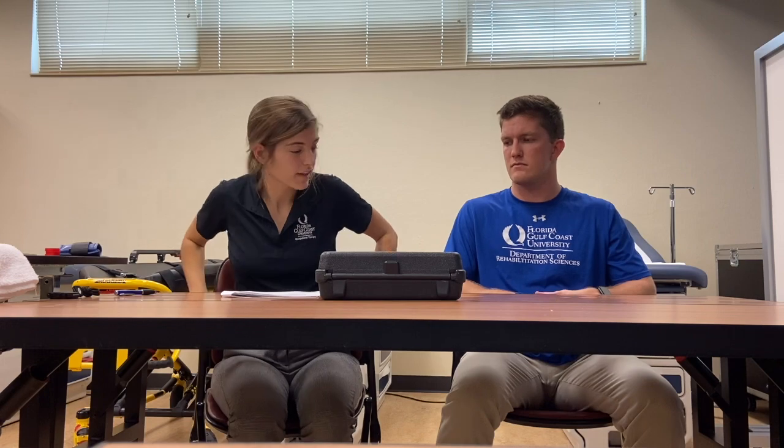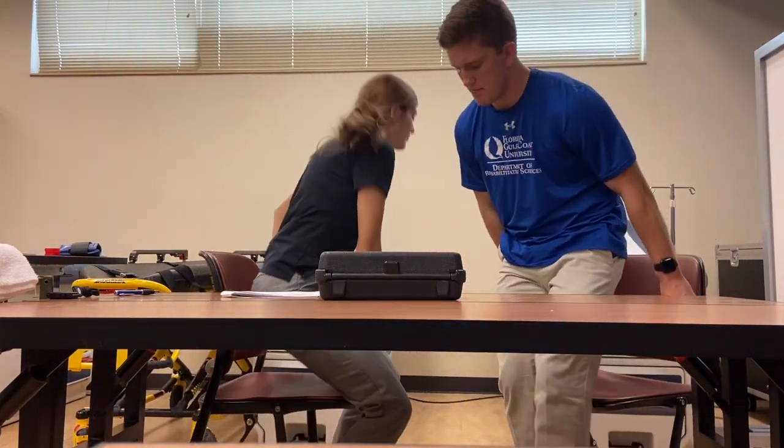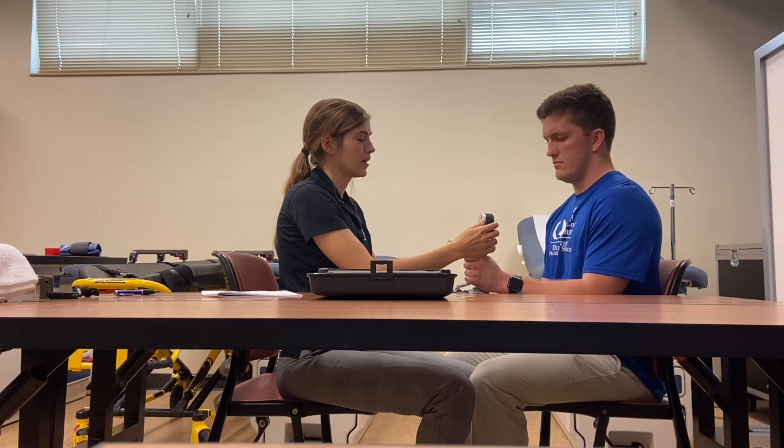For this next test we're going to be testing your grip strength. If I can have you stand up we're going to move the chairs once again. I'm going to go ahead and have you bring your arm out like this. You are going to squeeze onto this as hard as you can for at least three seconds. We'll be doing this three times with a one minute break in between. Ready, set, go. And release. Good job. Now you can go ahead and take a one minute break.